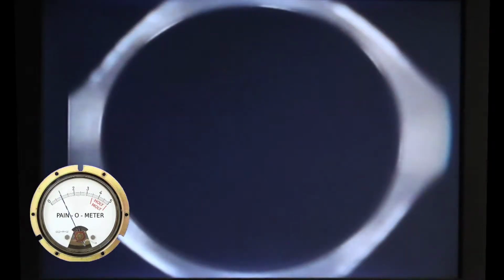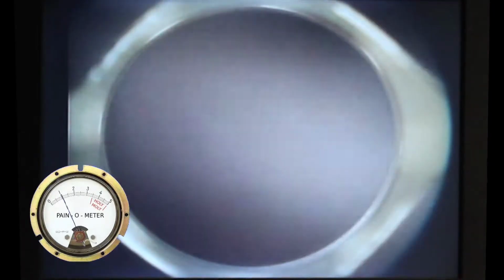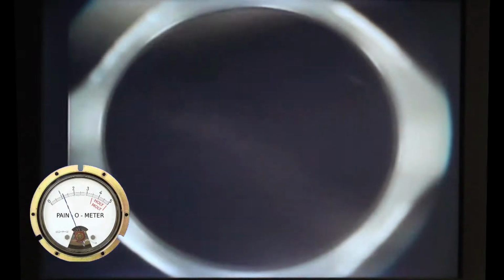And this is a little uncomfortable. That's the only bad part about it. I mean, the rest of the surgery is no big deal, but this is just so strange. You don't really know what to do. So they put this on you and they say, hey, look at this little blinky dot. There's this little blinky dot target that you're supposed to stare at, and there you go. That's all you do. So you look at that dot like there's no tomorrow.